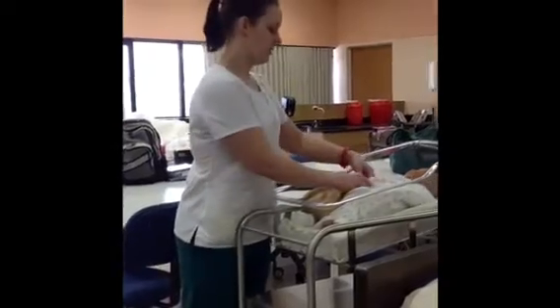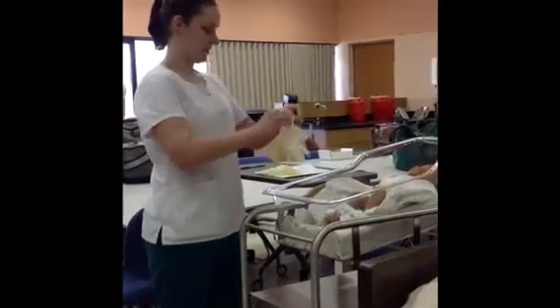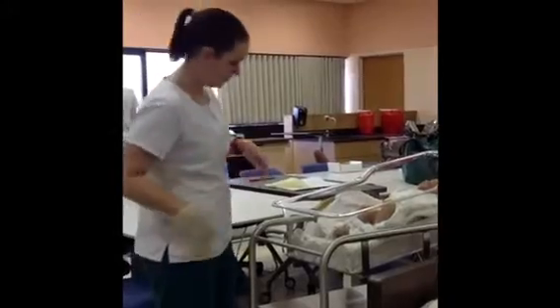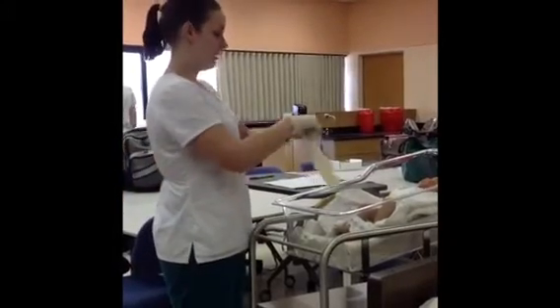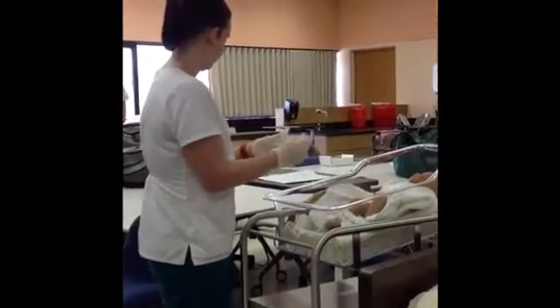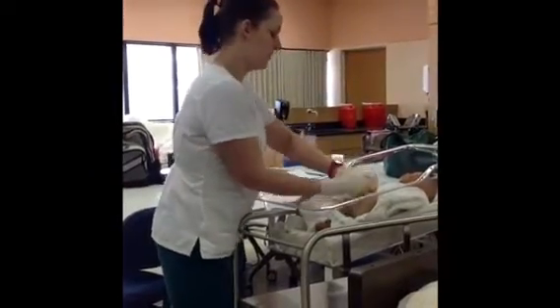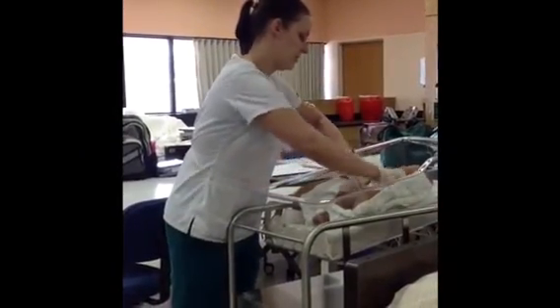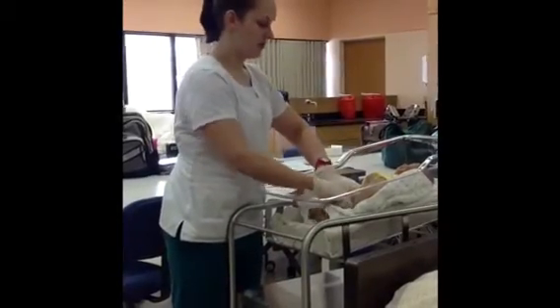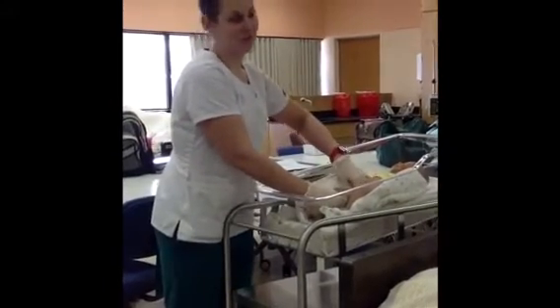I would open up the baby stuff and put my gloves on. I'm going to undress the baby, at least from the waist up, and open the diaper so that I can visualize where I need to give the injection. I checked my expiration date, which is 2/20. I could also cover the baby with a little towel or a cloth for privacy, or even to make sure that the baby doesn't urinate. Well, if the baby urinates, at least there'll be something there.